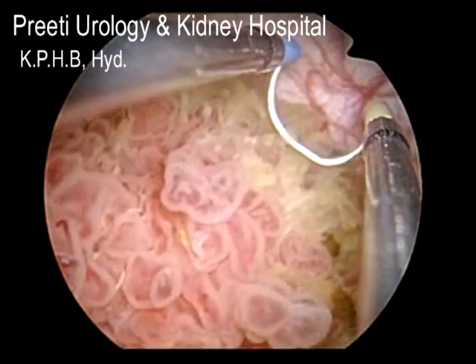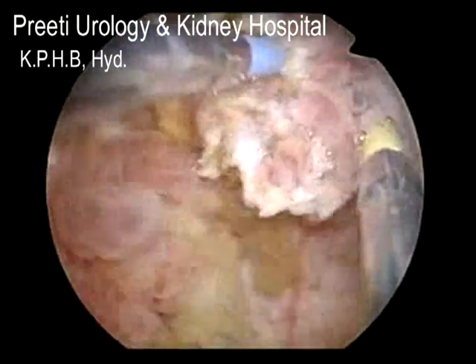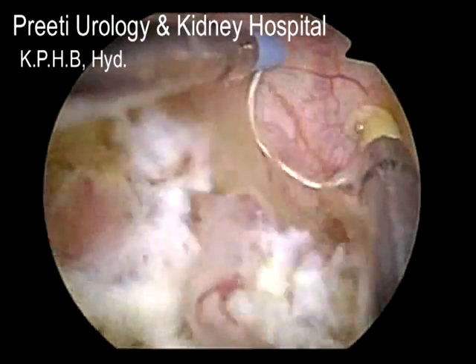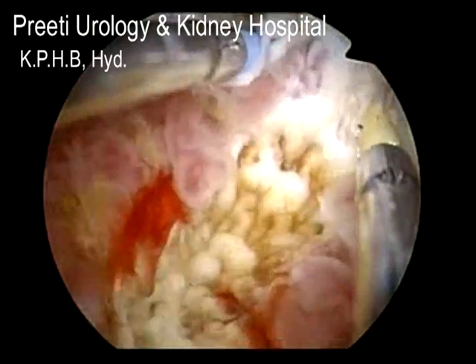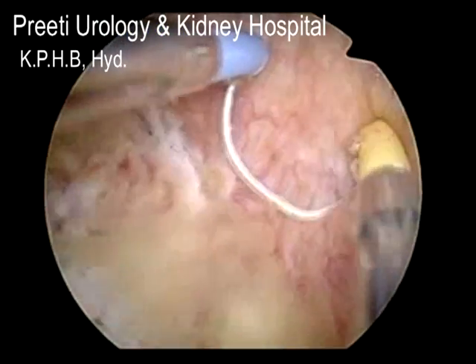We will activate, and you can see nicely it is a very beautiful equipment, bipolar, where you need not worry about the current going outside the bladder. It nicely resects and removes the entire tumor. This is the way it clearly cuts. You should have perfect control. If you go deep, the bladder can be perforated.